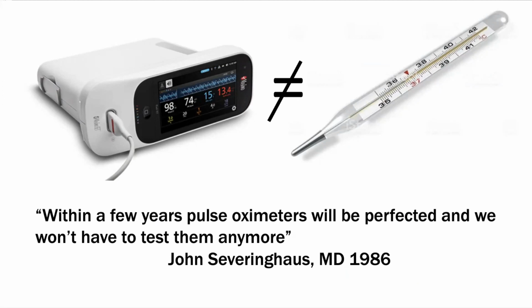And I'm fond of this slide because it highlights a crucial point about this technology. A pulse oximeter is not a thermometer. It doesn't yield a single value which is absolutely believable. Think about what a thermometer does. You can measure the temperature of the air, of alcohol, of water, of any liquid. It will work at high altitude, at sea level, or the bottom of the ocean.